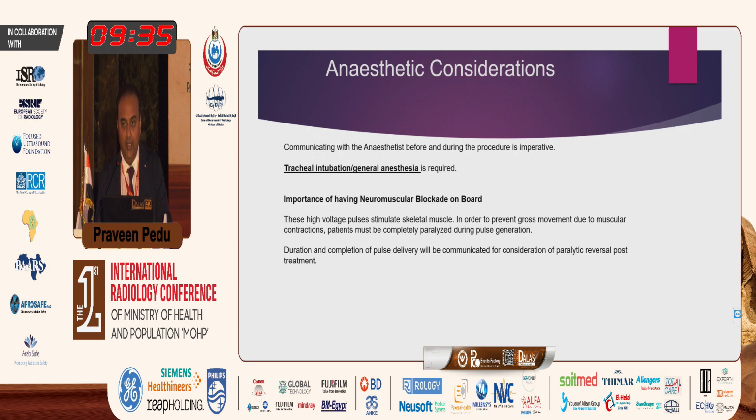Anesthesia is important here. The anesthetist whom you're working with should be fully aware of the procedure you're doing. For normal microwaves, we tend to use strong sedation. They don't always intubate the patient. But for NanoKnife, we insist on patients getting intubated and completely paralyzed, because NanoKnife uses high voltage electrical energy, so you tend to cause neuromuscular stimulation. You can cause a lot of neuromuscular activity, and you can cause twitching within the patient. So it's important the patient is completely paralyzed and ventilated for the procedure.